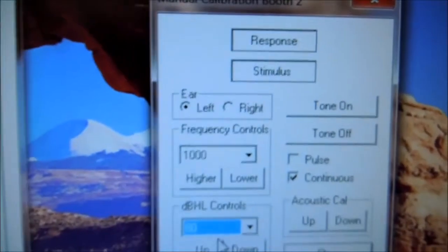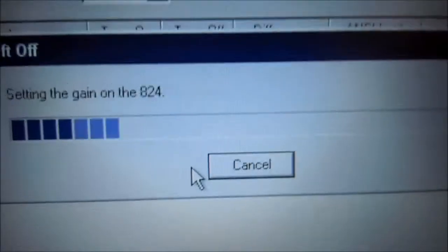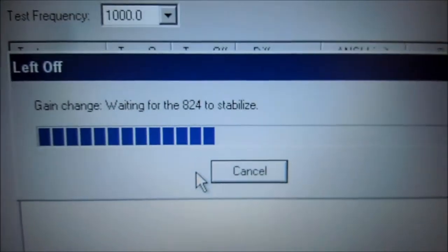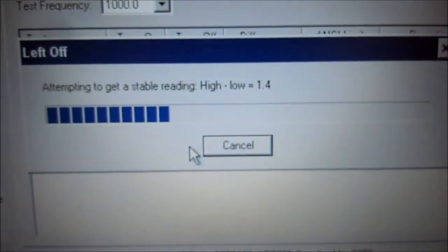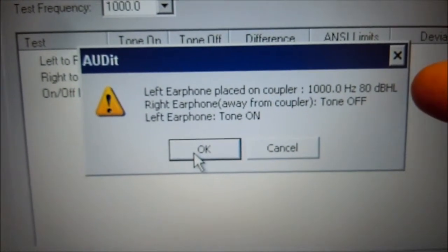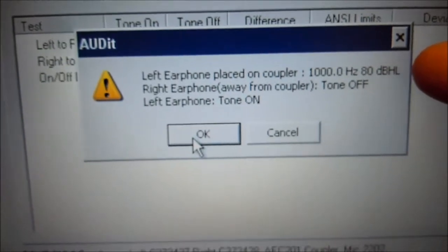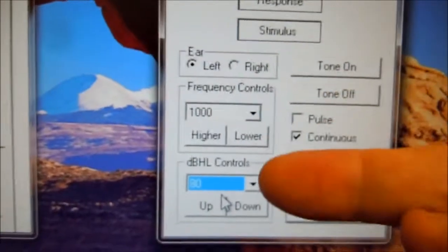Move the right ear down to the ground, and we're not going to have any tones selected. We're going to come back here and press OK — it's measuring. Now we're going to take the left ear, place it on the coupler, which it already is, and we're going to have 1000 Hz at 80 dB.